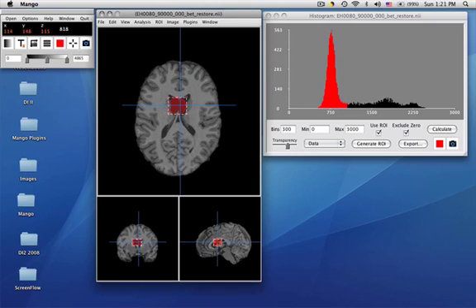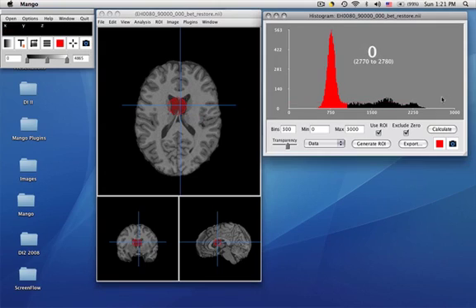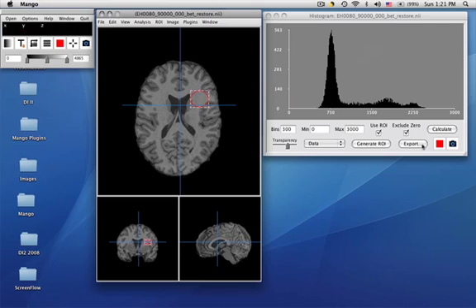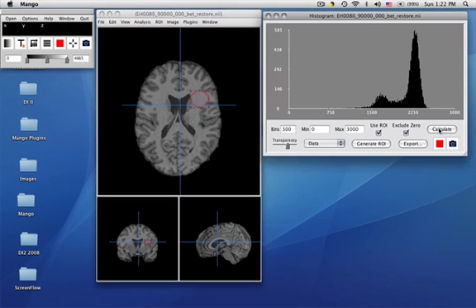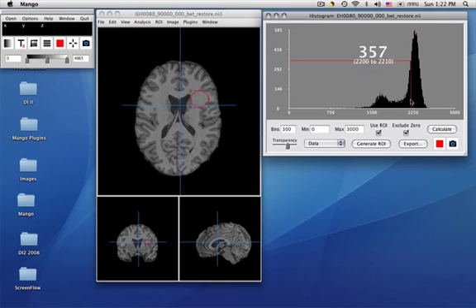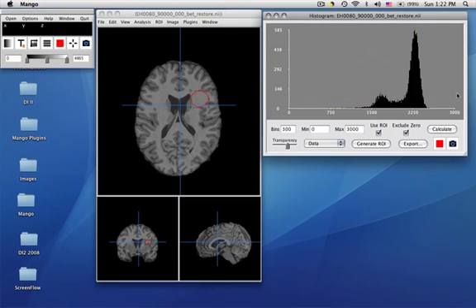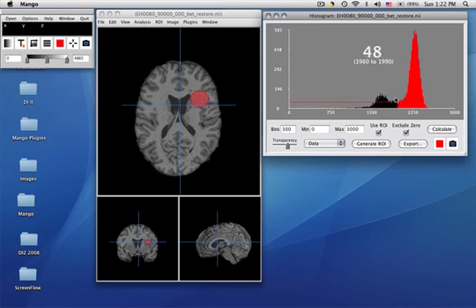Let me bring this up to the center of the view. And if we move this region of interest off into mostly white matter and recalculate, we see that we're getting mostly white matter and nearby gray matter. So this is a nice feature in that we can highlight things within a region of interest. So we can use a region of interest as sort of the blocking range and highlight things within it.